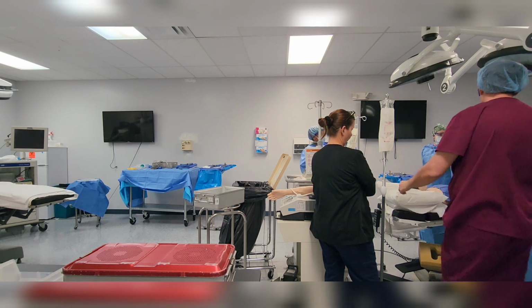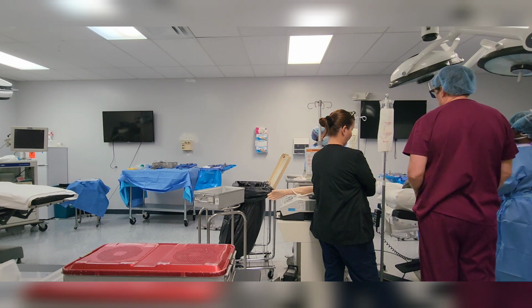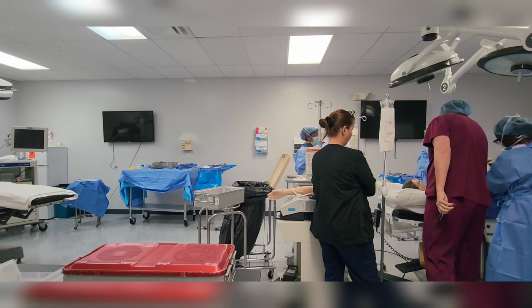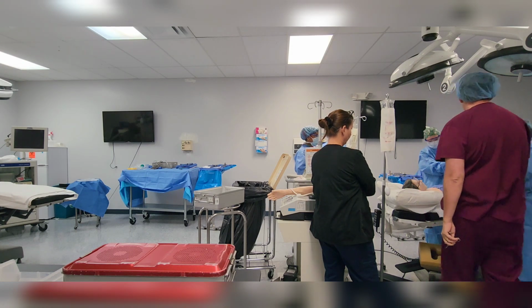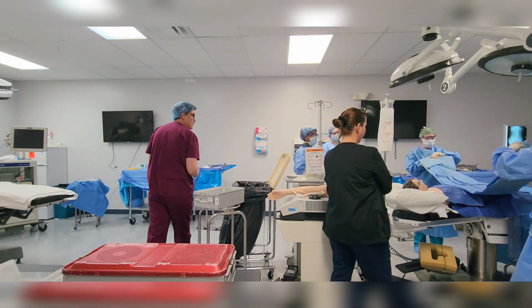Are we taking the tape off on these? That's a good question. I'll verify. In this case, let's leave it on because we probably want to reuse the drape. So try to get down to this slice. Yep, set it down onto it, and then open up. Watch your hand, Kareen. You can't put it underneath. Don't put it underneath. There you go.